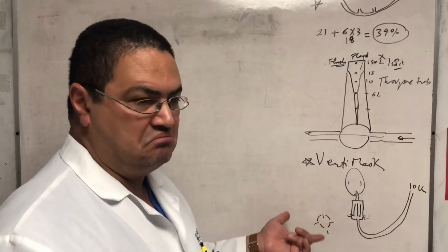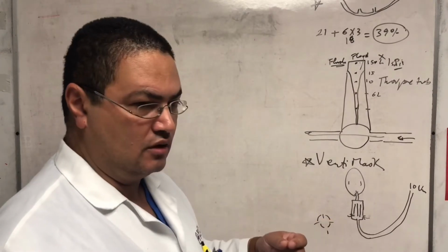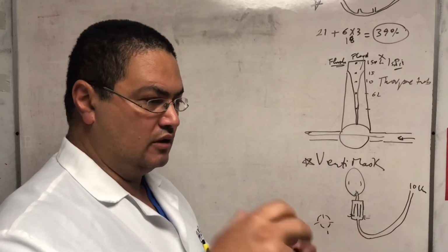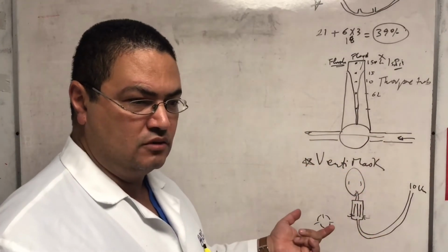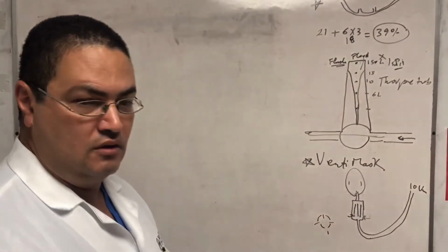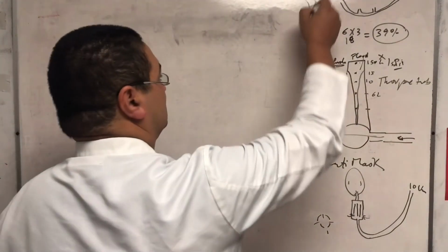So for me, why agonize over the red color or the orange color, where I can just increase the flow or decrease the flow with oxygen, and that affects the FiO2 that's going to the patient. And everything is rough estimation. There's nobody that can measure the FiO2 in the patient's nose. We can invent something like that, but it's not necessary, right? You're titrating for effect.